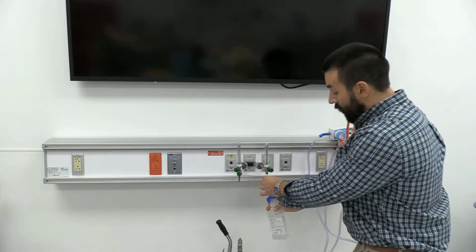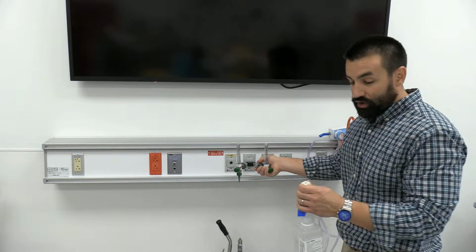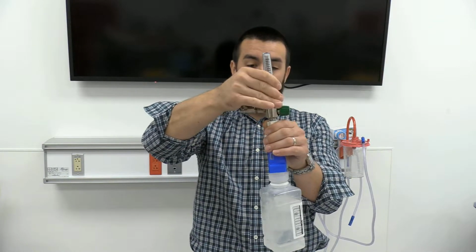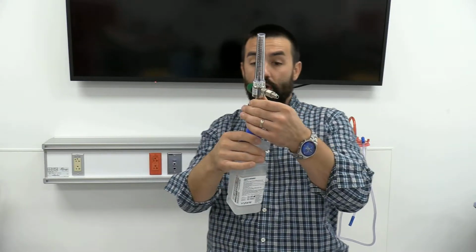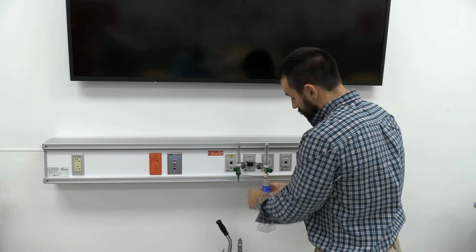So these thread on, same deal I've warned you about with the bubblers. Anytime you're threading plastic onto metal, we're worried about stripping that out. So if I can't get it to go on really easily, I'll pop that flow meter out and make sure it goes nice and easy. You don't need to death grip tighten it. If it's not going, something is wrong. You're trying to get it cross-threaded, and then this just ultimately hooks on like this.